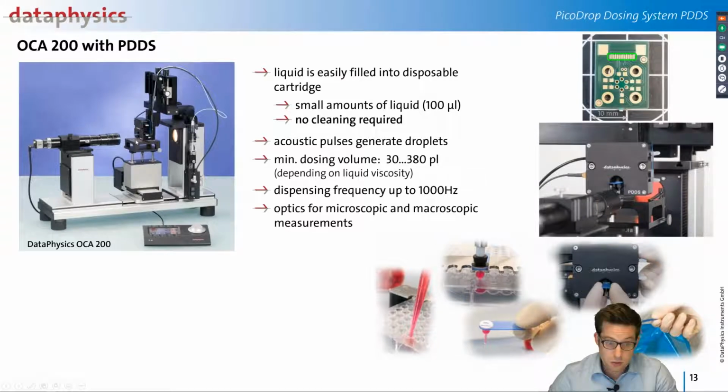Of course, to see these very tiny drops, we need to have microscopic optics. So these are really small substrates already. So you see this microscopic optics, and it's really nice.